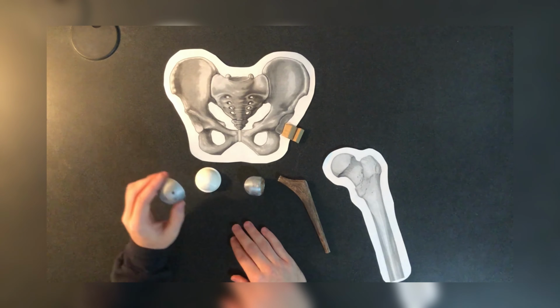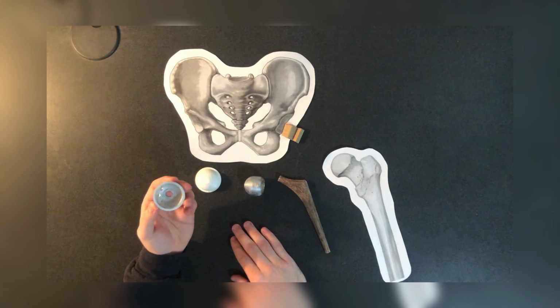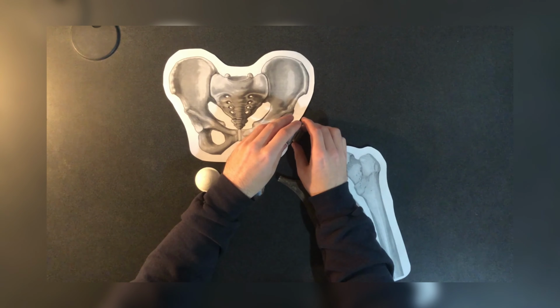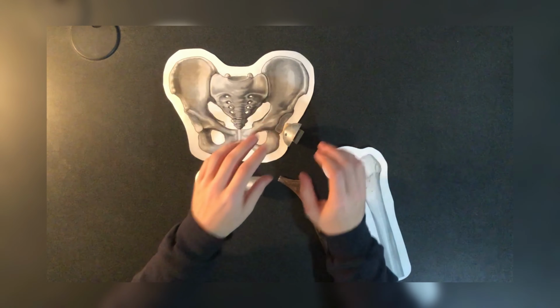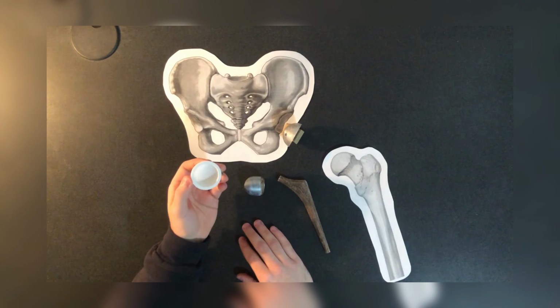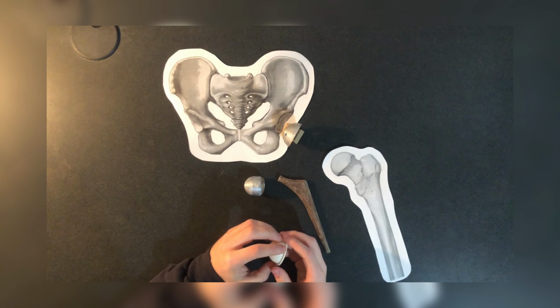First, the acetabular cup is prepared by securely fixing it into the pelvis bone using medical-grade cement or press-fit techniques. This ensures a stable foundation. Next, a plastic liner is placed in the socket to reduce friction, enhancing the longevity and functionality of the hip replacement.